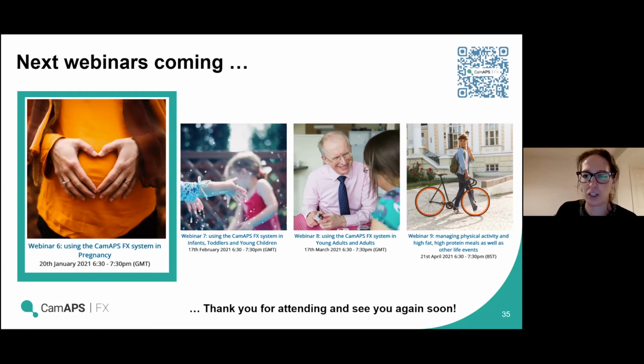It's a function that you can select within the app, and you can either say Boost now for however many hours you want, or you can preset it to come on at a particular time. Its opposite is something called Ease Off, which makes the algorithm a bit less aggressive and increases the target, which people use for exercise, and similarly it can be put on immediately or in advance. So they're like smart temporary basals, really, glucose dependent ones.